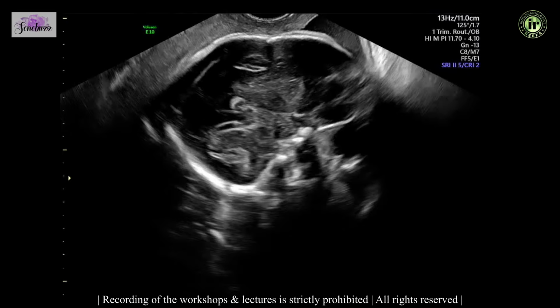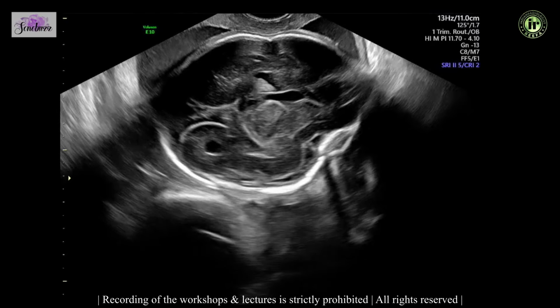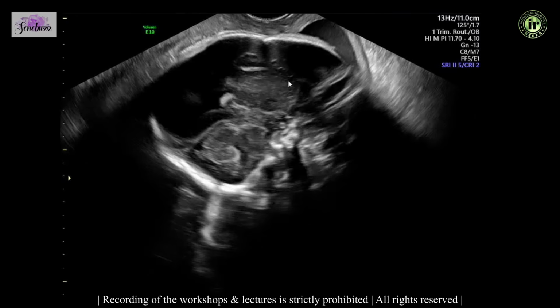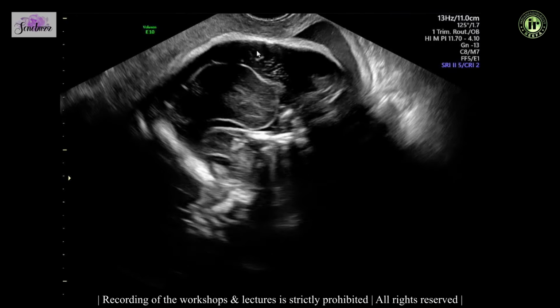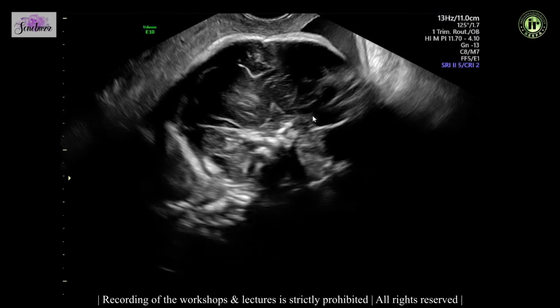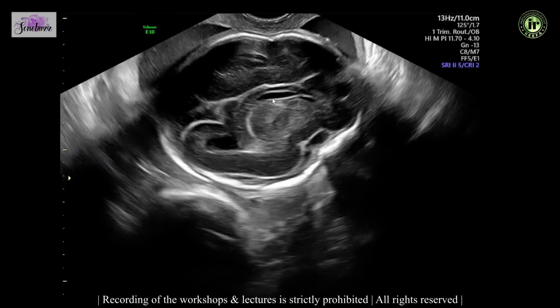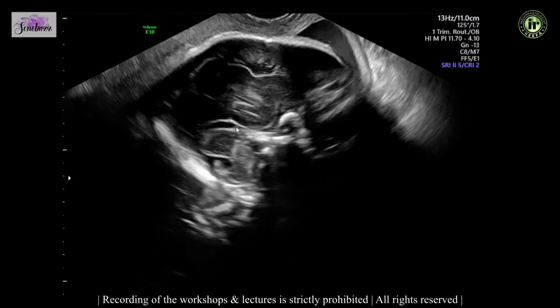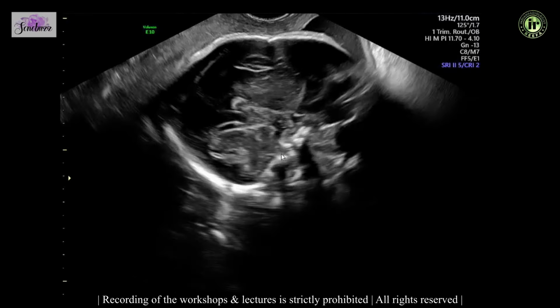Now this is a sagittal view. We can see that it's a slightly oblique view. That is the sylvian fissure on the opposite side, and that's the cavum, that's the corpus callosum. Not a perfect midline sagittal view. You can see the cerebellar vermis here.